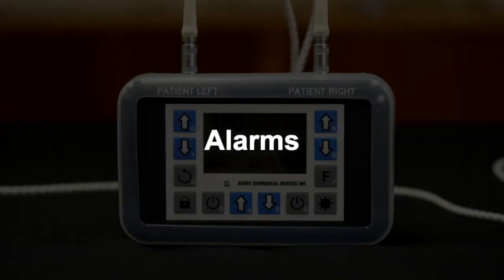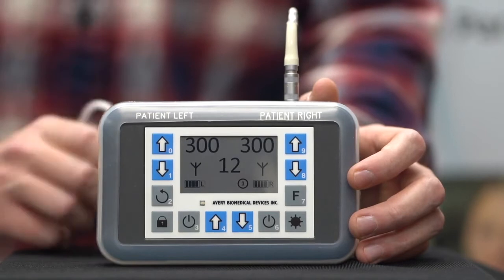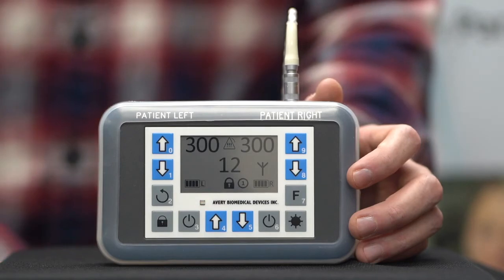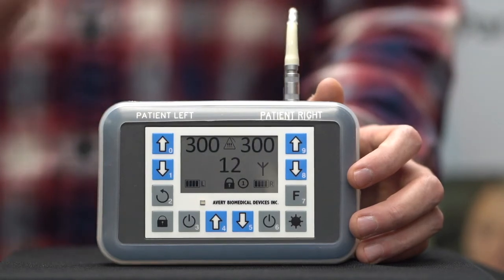Alarms. The Spirit transmitter indicates alarm conditions through two types of alarms: sound alarms and visual alarms. If an antenna is disconnected from the transmitter while the corresponding side is still turned on, the speaker will beep, the LED indicator flashes, the corresponding antenna icon flashes, and the alarm icon turns on. If the antenna wire is damaged or broken, creating either an open circuit or a short circuit, the speaker will beep, the LED indicator flashes, the corresponding antenna icon flashes, and the alarm icon turns on.